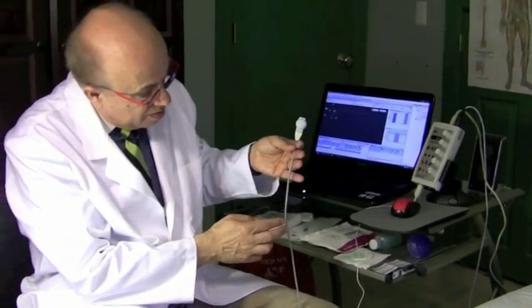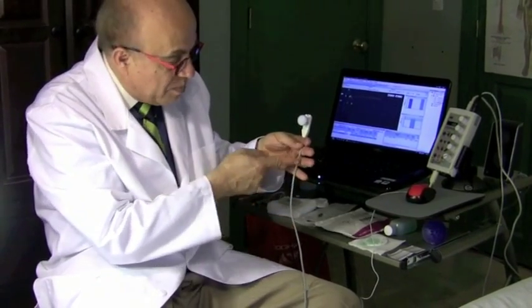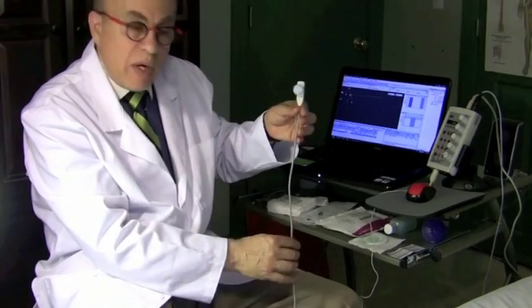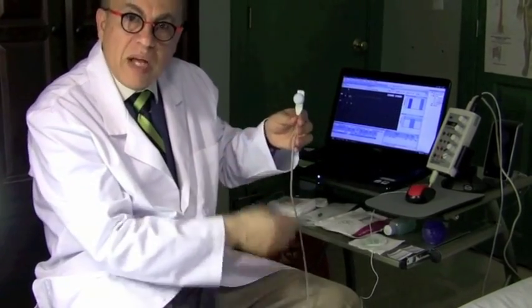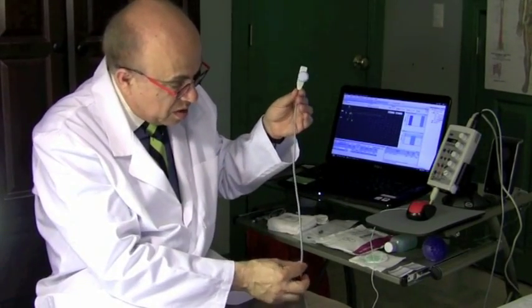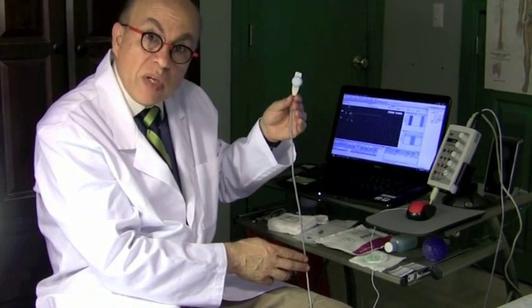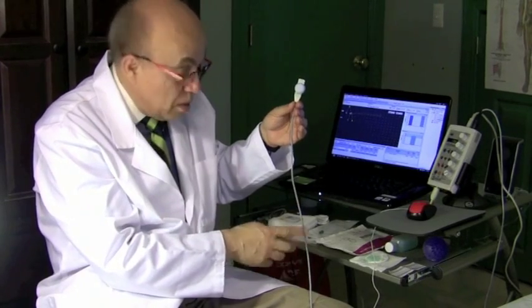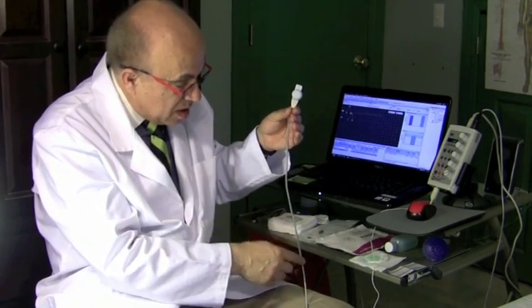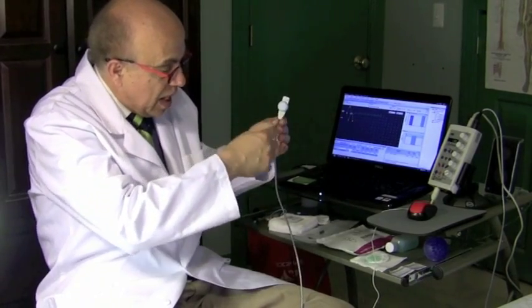If you're stimulating a nerve here, the electricity is not just traveling this way. The electricity is traveling up this way and down this way and all over the nerve, essentially. So you're stimulating the nerve everywhere when you stimulate the nerve. Here, electricity travels up and down. Let's say that this is the spine and this is the hand here, the wrist. If I stimulate the nerve here and I'm putting the recording electrodes at the wrist, I'm going to study the nerve from here to here. But if I'm stimulating the nerve here, and the electricity is going up and down, I'm also going to record the response that goes up the spine and comes back.